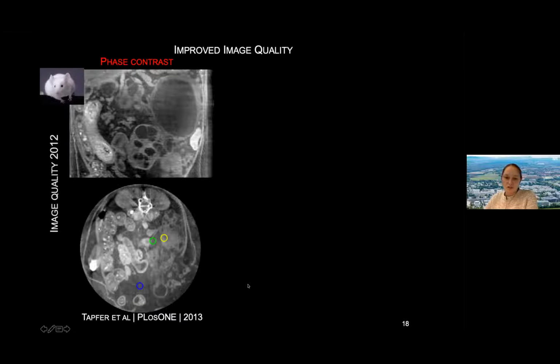We used a very old rotating anode with a molybdenum source, gold gratings and silicon gratings, so a 3-grating setup for the lab, and a photon counting Pilatus detector from the company Dectris. And this is what we got. You see that it can't compete with anything that we get from the synchrotron.